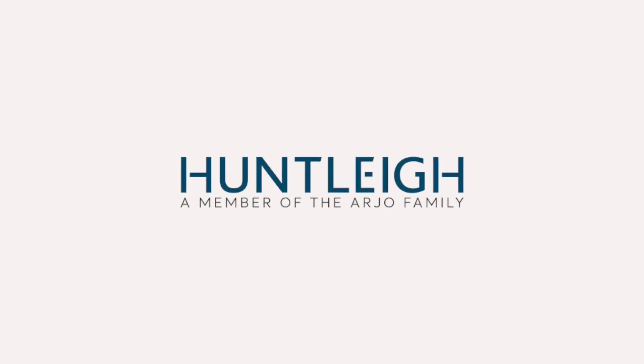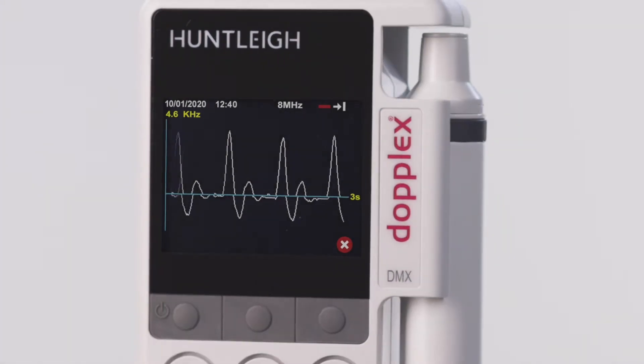Huntleigh, a member of the Arjo family, introduces a new dimension in sound and vision: the DMX Vascular Doppler.